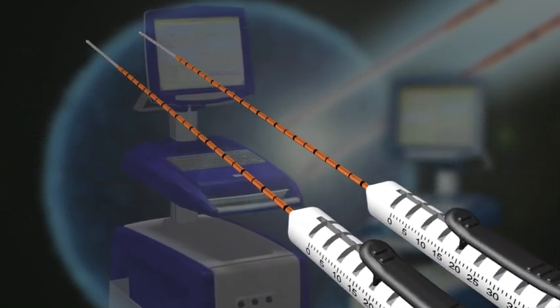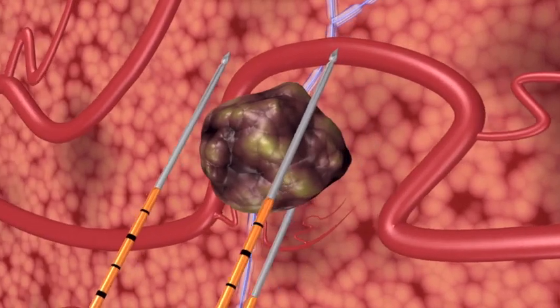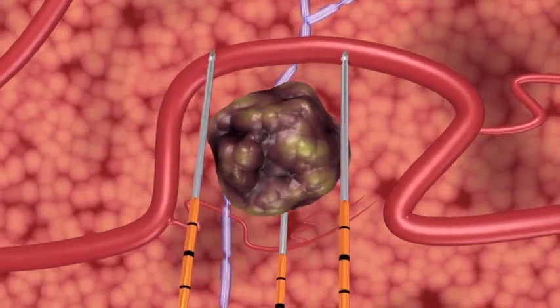Two or more NanoKnife disposable electrodes are positioned in or around the area to be ablated, and an electrical field is created between them in a series of microsecond pulses.